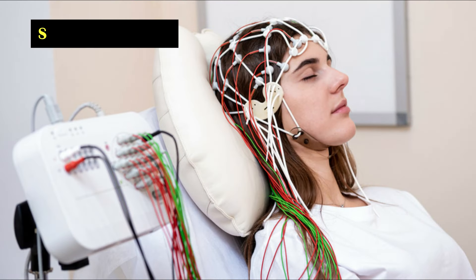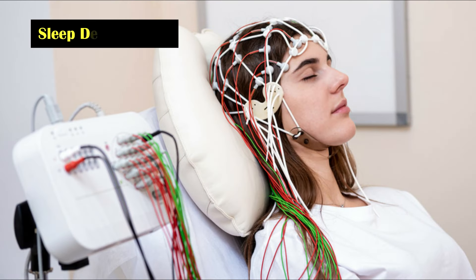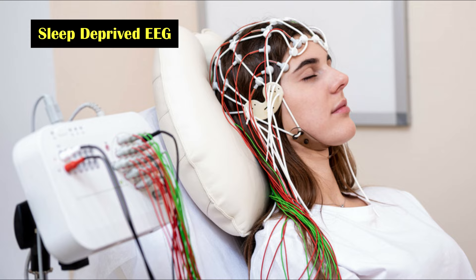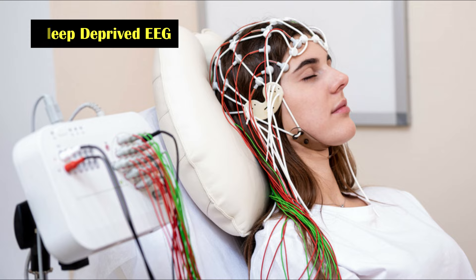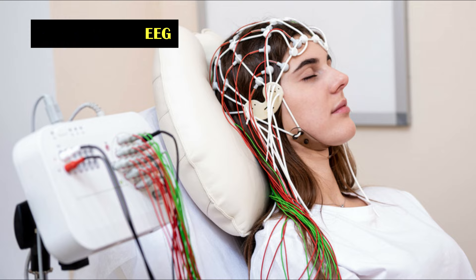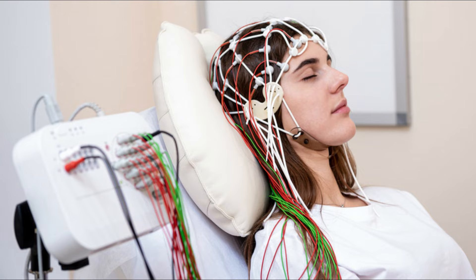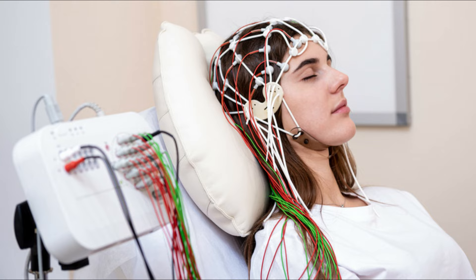Sleep-deprived EEG is another type of electroencephalogram. This test is done while the patient is asleep. It may be used if a routine EEG does not provide enough information or to evaluate for sleep disorders. Most often, patients are asked to stay awake the night before the test to help ensure they can sleep during the test.